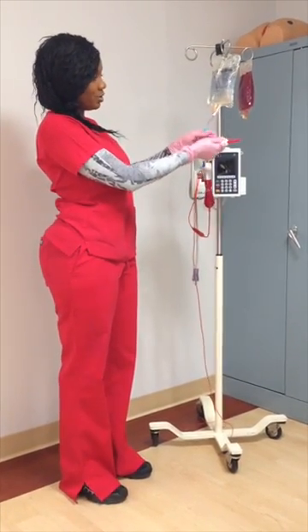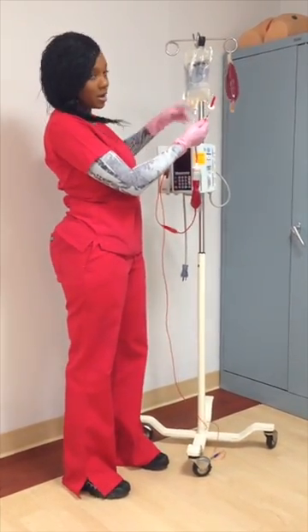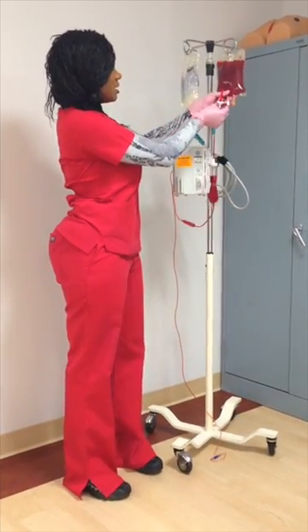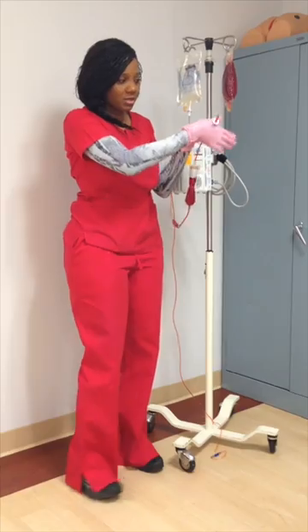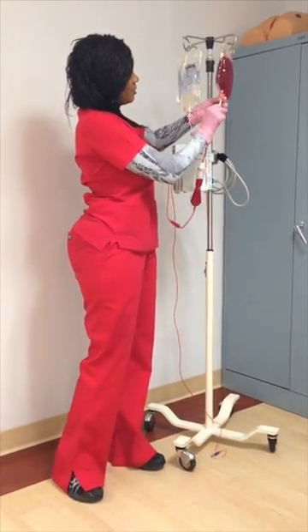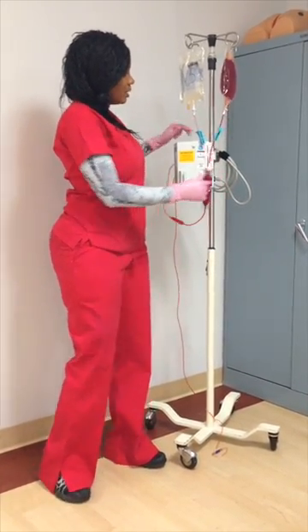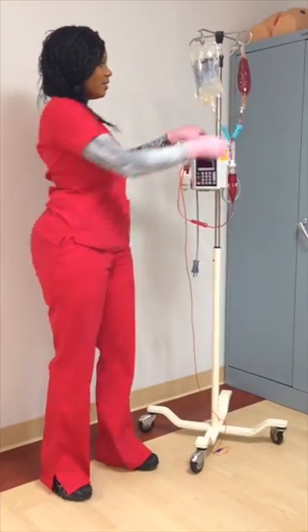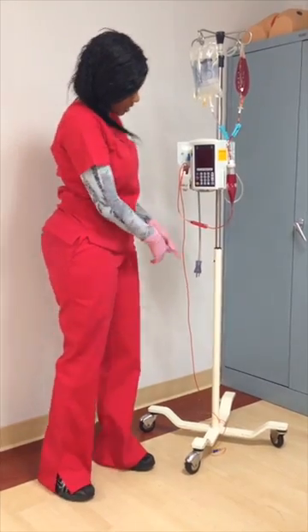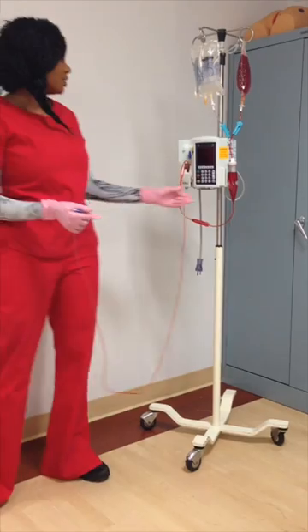After that, you will close off your normal saline — if you don't, if you open this, it'll all back up into your normal saline. Close off your normal saline, open up your packed red blood cells, spike, open, and squeeze. At this time you will leave this tubing open, allowing the blood to circulate down and prime to the end. This is called priming, just like you would with any other solution.